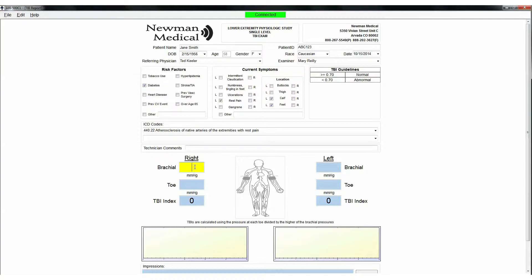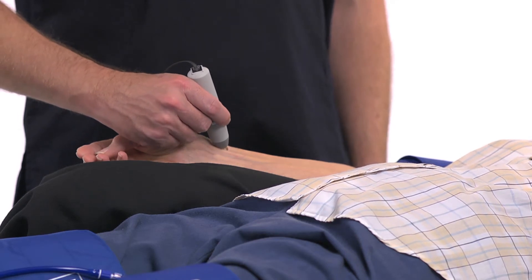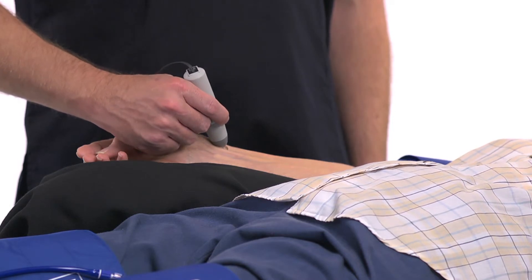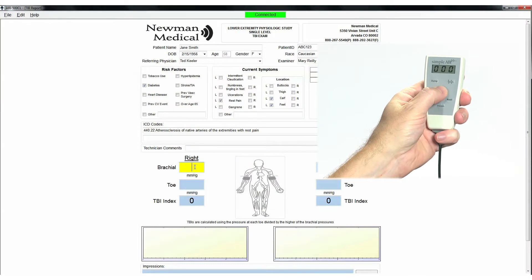Use the computer cursor and click on right brachial site. Place the Doppler probe at an angle to the skin over the radial artery. Move the probe slowly back and forth until the strongest arterial signal is heard. Press and hold Inflate on the cufflink remote and inflate the cuff until you no longer hear the signal, then continue for an additional 20 millimeters.